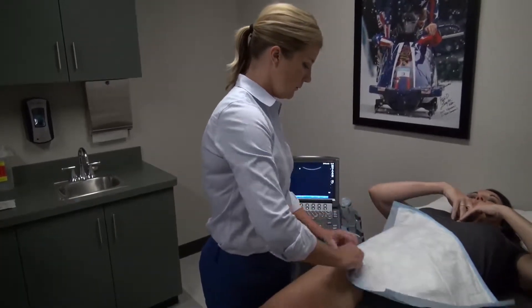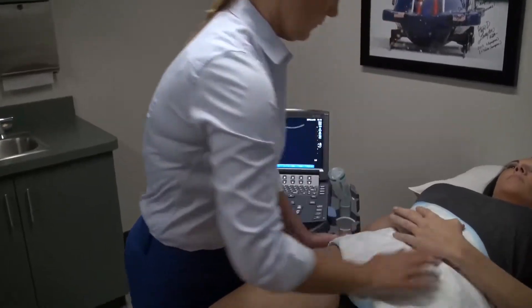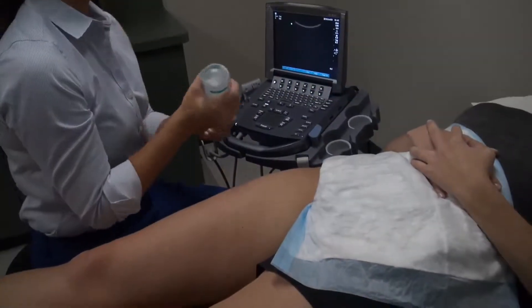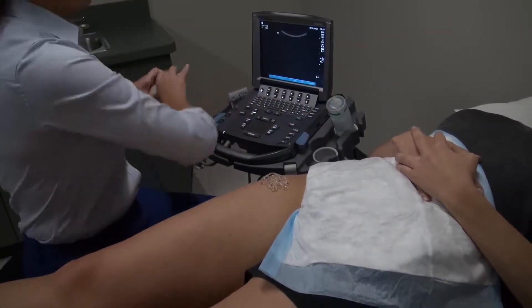The ultrasound machine is placed on the side of the patient's symptomatic hip and positioned in front of the provider. Our center uses a Sonosite mTurbo ultrasound system. Prior to the injection, a curvilinear transducer is used to perform a survey scan of the hip joint anatomy.